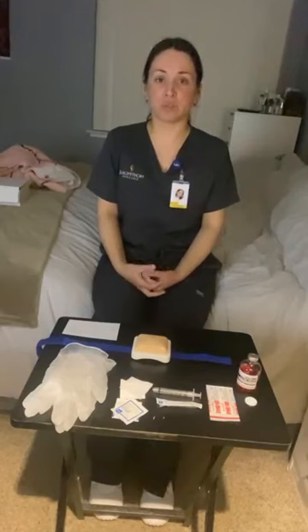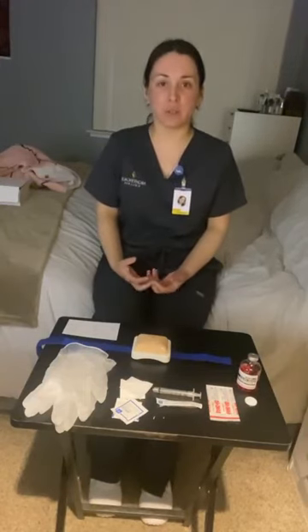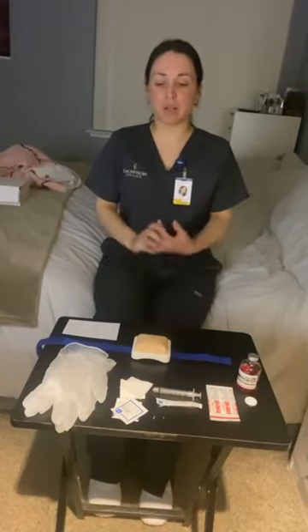My name's Kayla. I'm going to perform administration of intramuscular injection skills video. So first I want to verify the healthcare provider's order. I'm going to gather my supplies.